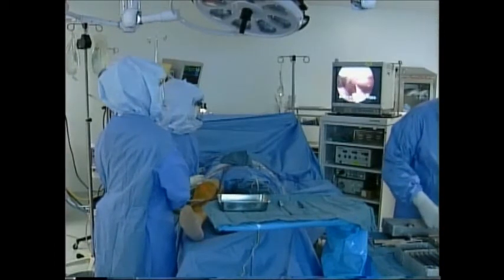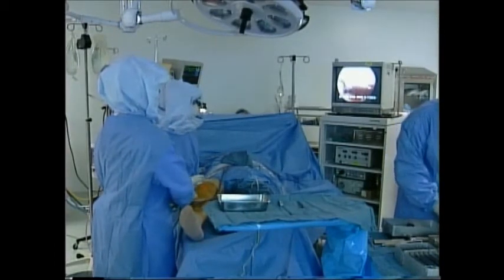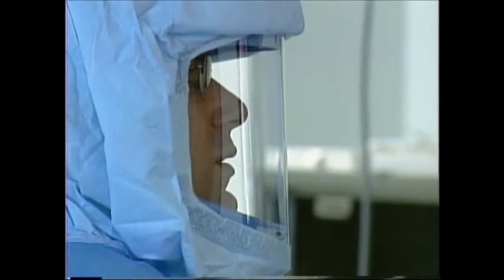This is the kneecap coming into view up above. Here's how the surgery works. First, Dr. Klubinoff uses a small camera to double check the area of the knee that is damaged.